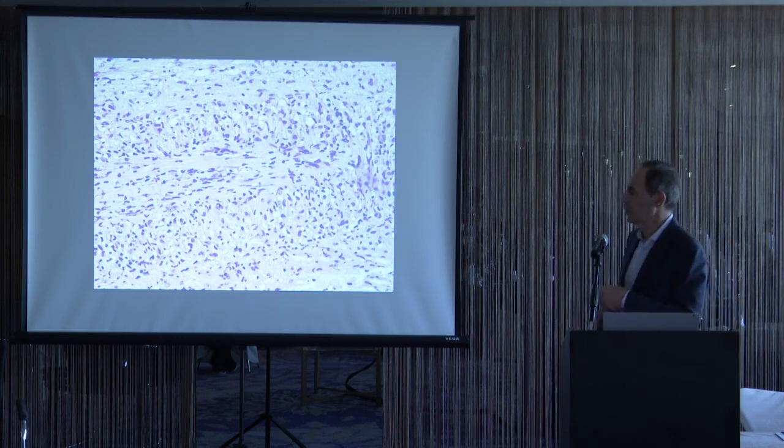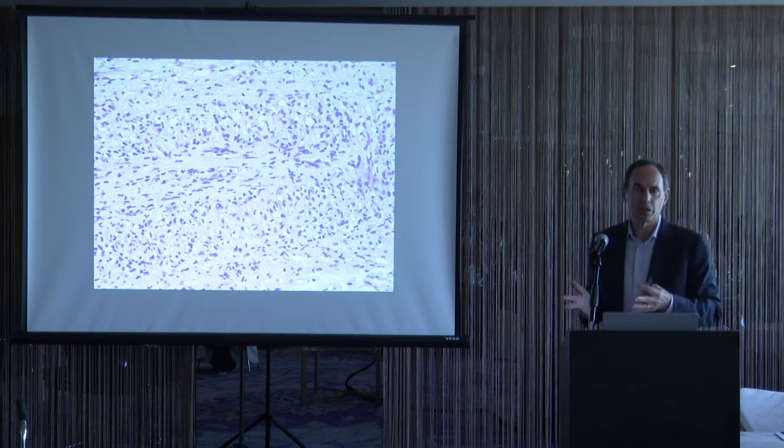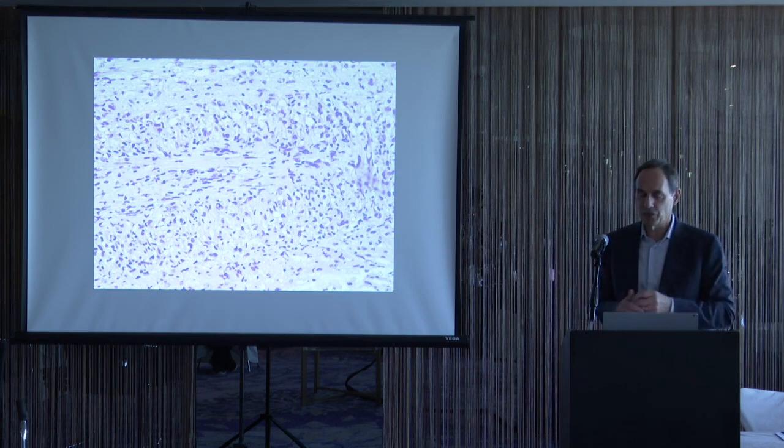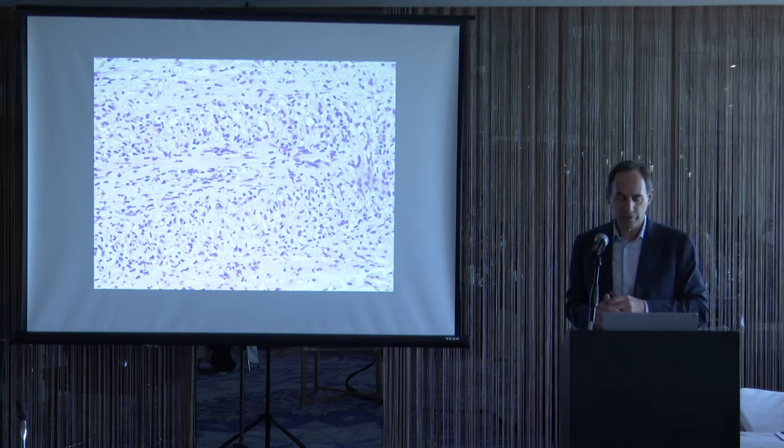If I see a granulomatous vasculitis, like we see here, lymphocytic granulomatous vasculitis, I will say these vasculitides are more associated with a systemic granulomatous disease, like I mentioned, granulomatosis with polyangiitis or Churg-Strauss, and patients should be evaluated for that.